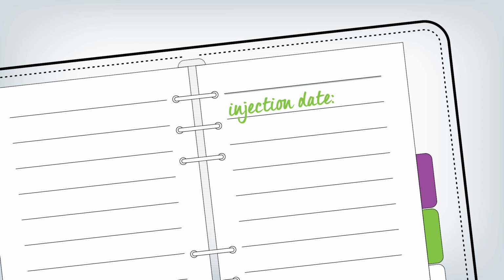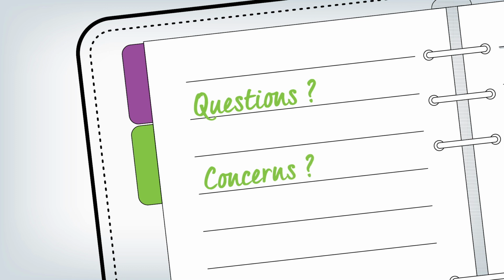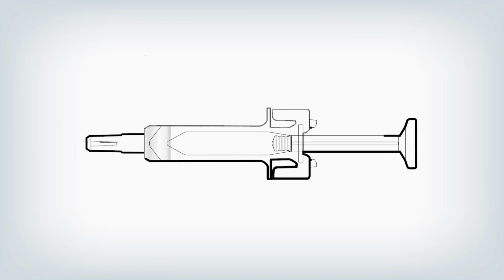Write the date, time and specific part of your body where you injected yourself in your treatment diary or record it in a diary app. It may also be helpful to write any questions or concerns about the injection so you can ask your healthcare provider. It's important you feel reassured you have the confidence to self-administer correctly.